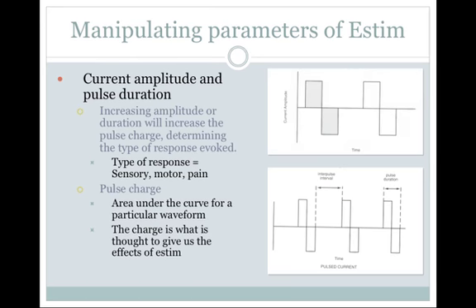So if we talk a little bit more about the pulse duration, we can also vary that usually within the edit screen. Usually it's a little more difficult to change the pulse duration, but that's easily done on most machines now. And you can see I'm able to change the width of those, and as a matter of fact on some machines it will be called the pulse width. It's actually a bad terminology, but you'll see it called that.